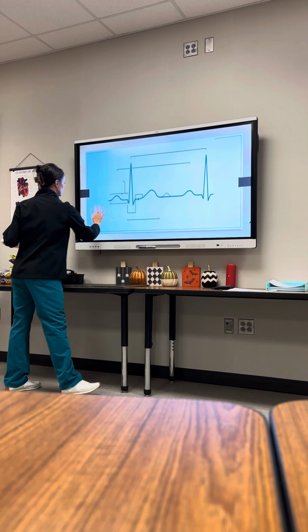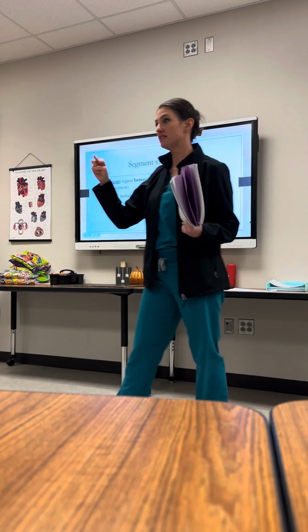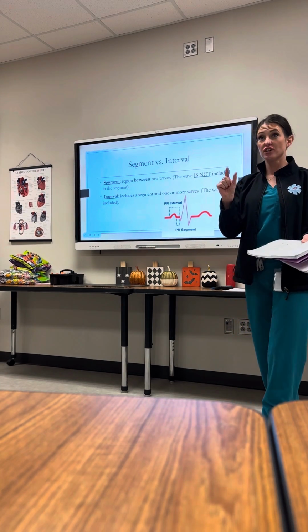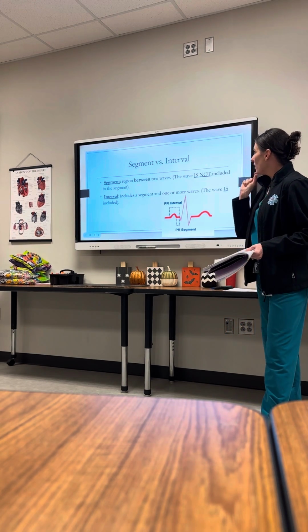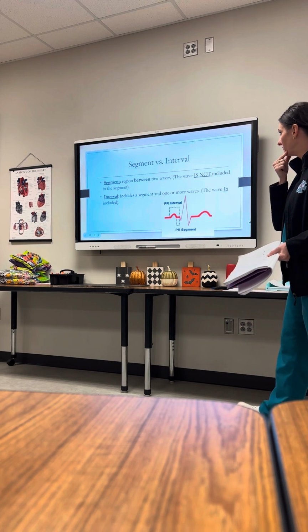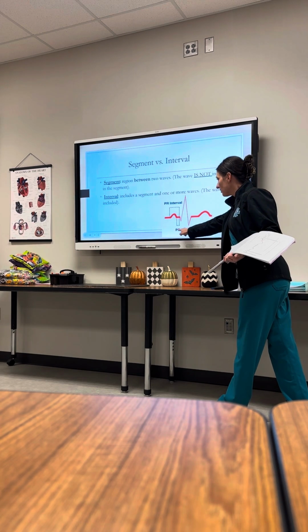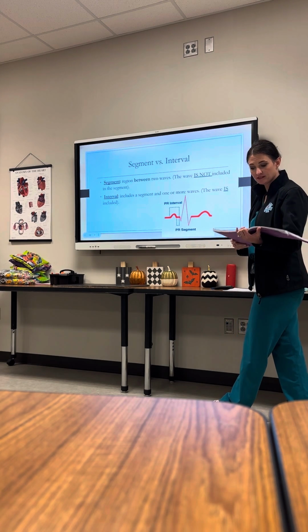I think we're ready to move into our segments and intervals. So what I want you to do first is define it. On page 50, in the middle of the page, let's define what a segment is in an EKG. It's a region between two waves, okay? The wave is not included in the segment. And we'll look at a couple of them. If you look at our image here on the slide, this bottom one is pointing out the PR segment. And we'll take a closer look at it in just a second.